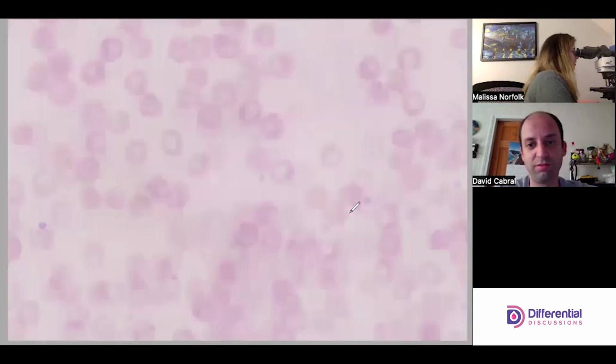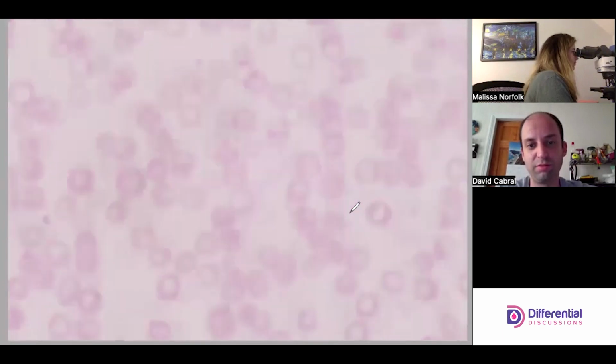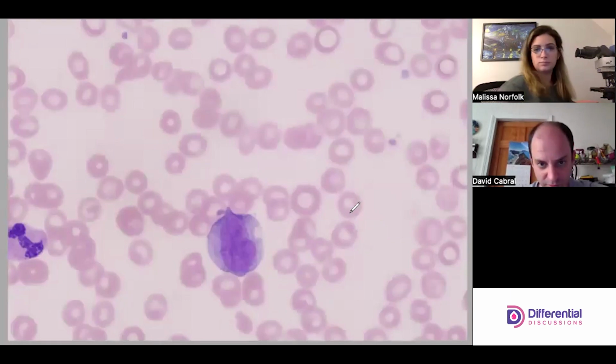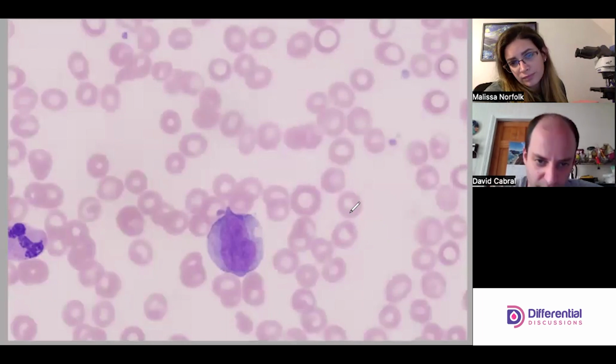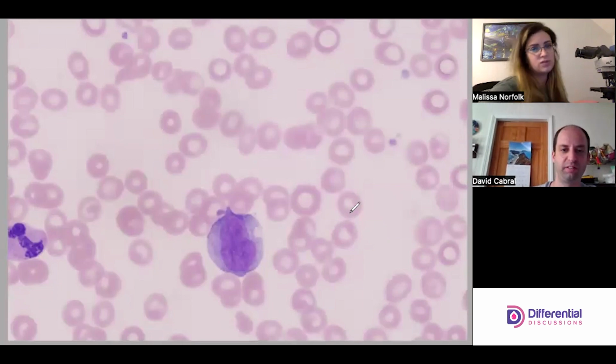I guess the pro monos were in a little bit thinner of an area. I think he's a mono. I can see some nucleoli looking things in there, but I still think it's just a mono. Some of those striations catch my eye, but it's too mature.